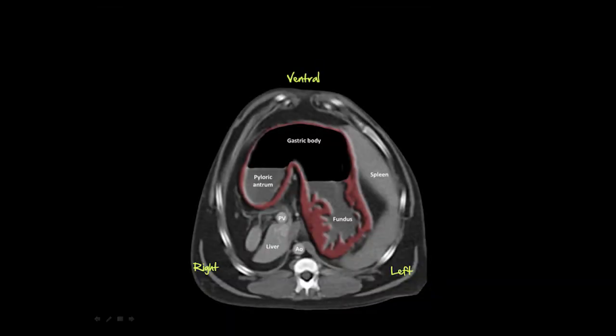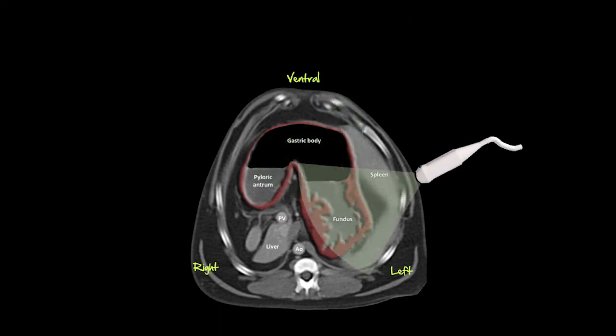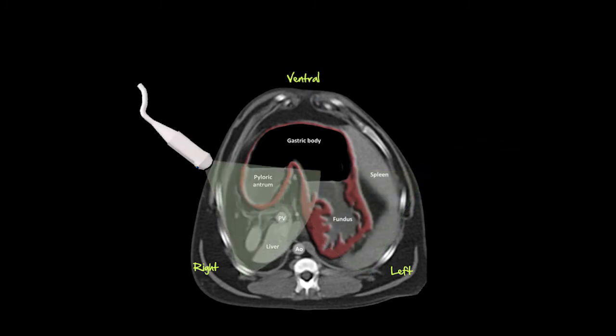While technological progress has eliminated certain barriers, the main obstacle in GI ultrasound imaging is the GI gas and digesta, which tend to create several artifacts that can not only limit the assessment of the GI itself, but of the underlying structures also. But if we carefully plan the positioning of the probe to take advantage of the best acoustic windows, we can access and examine most of the regions of interest.